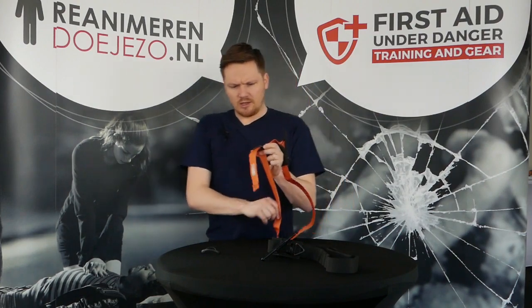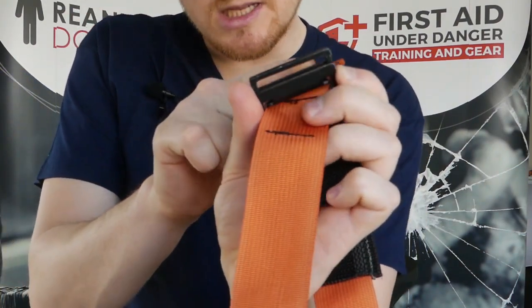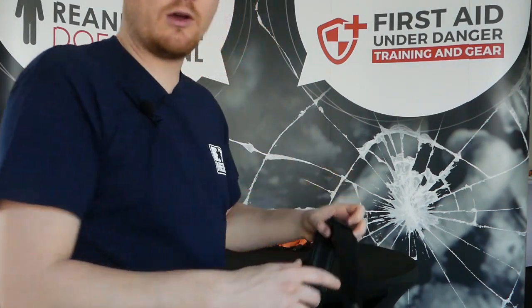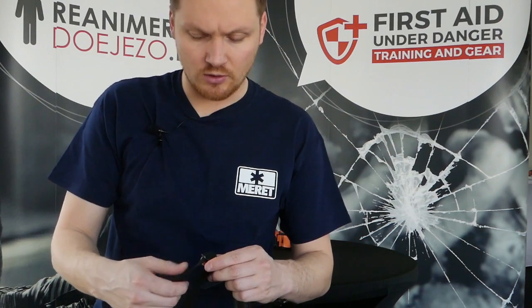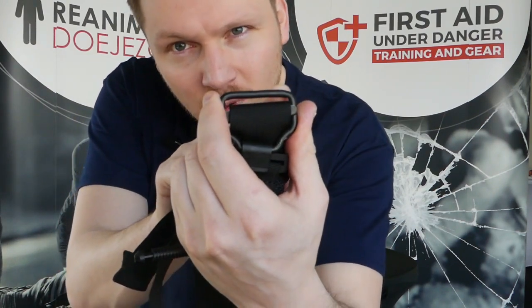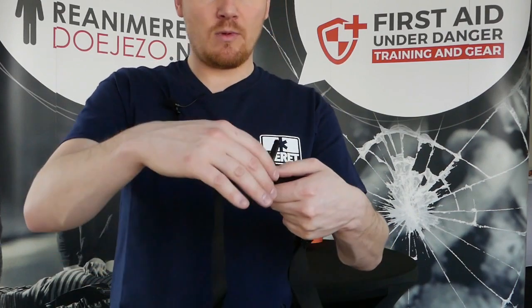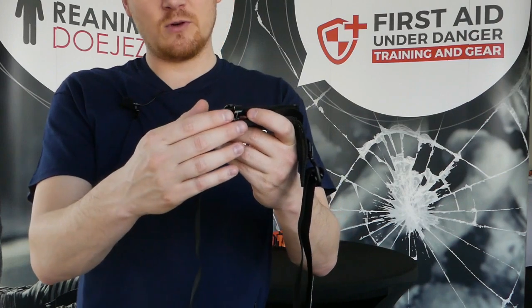If you take a look at this one, you'll see that this was far more squared out, so that is something they already changed. For example, also in the previous versions of the SOF, so the Generation 3, they already changed it to a little bit more rounded off. So that means that it's much easier to do self-aid. And now, if you have the full tension on there, you just need to slide it in here for self-application.